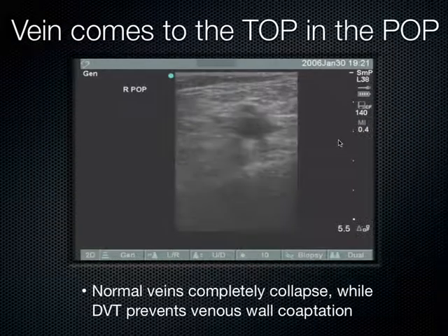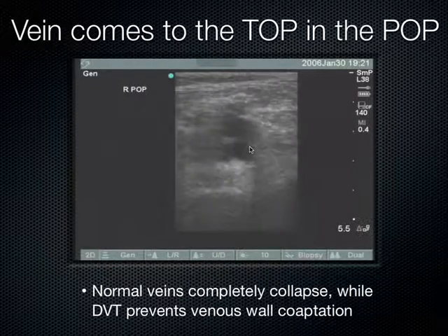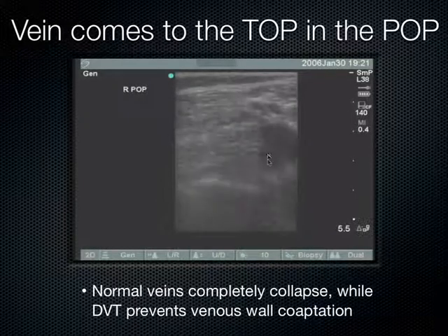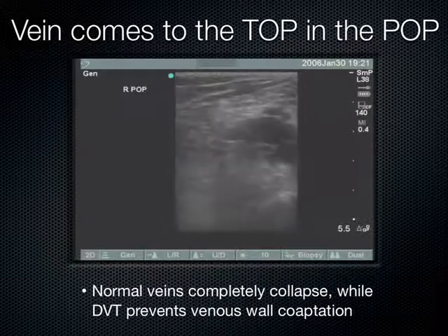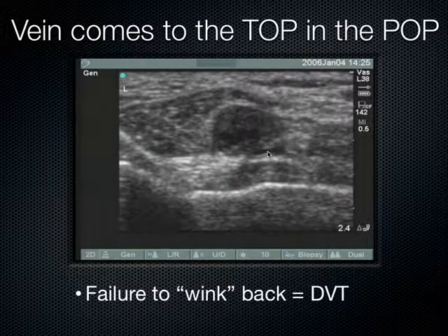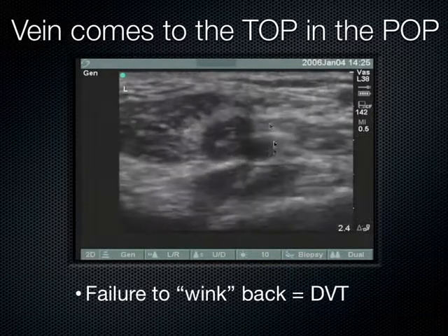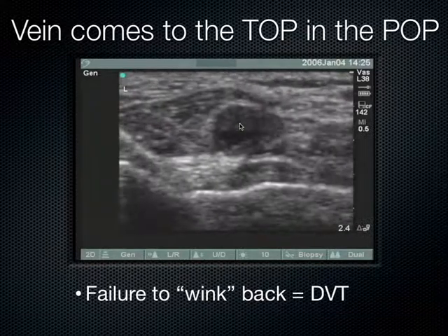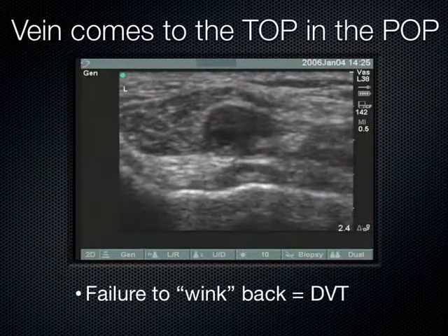In the popliteal fossa, the vein comes to the top of the pop and is nicely compressible in a normal study while the artery remains open. When there's a clot, the vein appears dilated with echogenic thrombus and does not compress. This is a positive DVT.